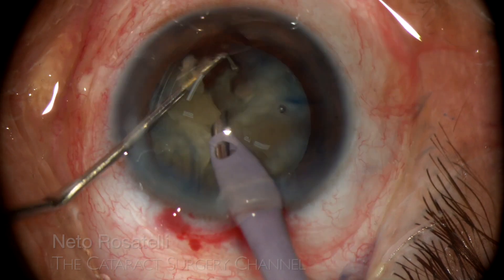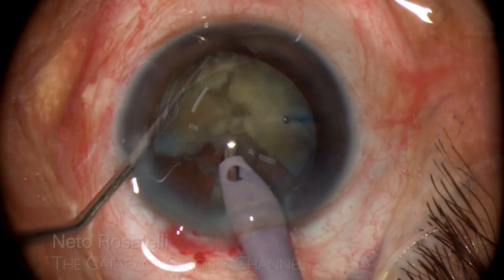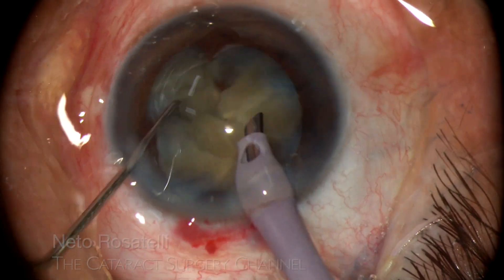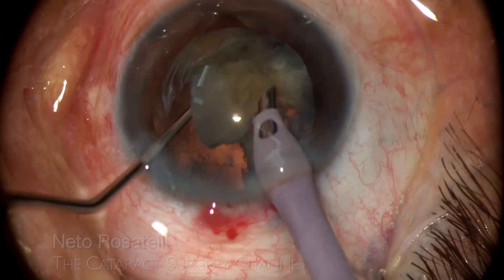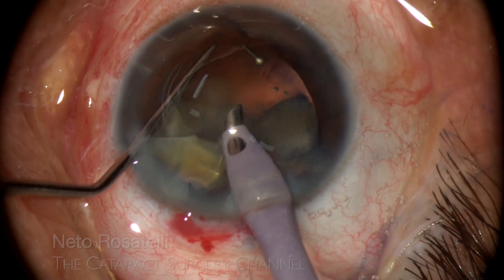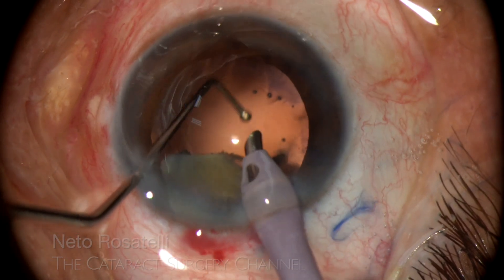The cracking was incomplete for some pieces, and that was an error. I resort to going with the phaco probe for the posterior plate still attaching the pieces and emulsify it. But the smart and safer move would be to stop, reposition the pieces back in the bag, and proceed separating them one by one from the other.